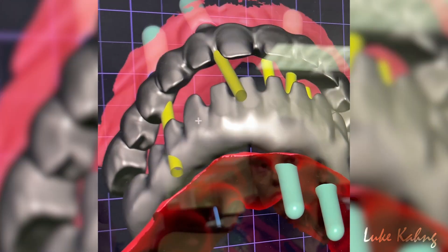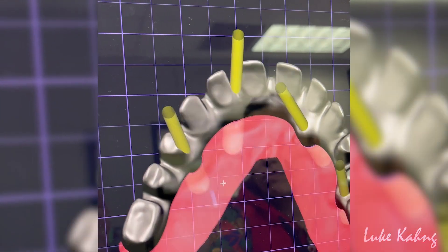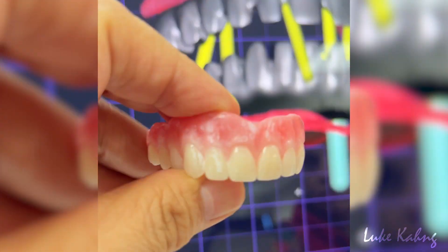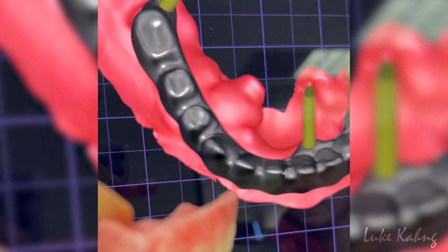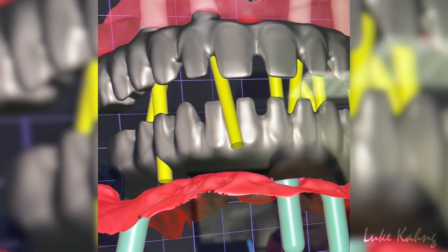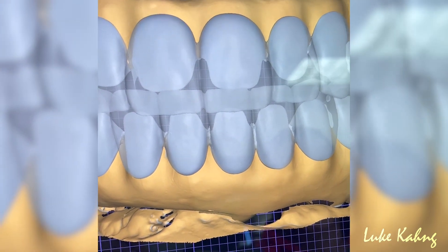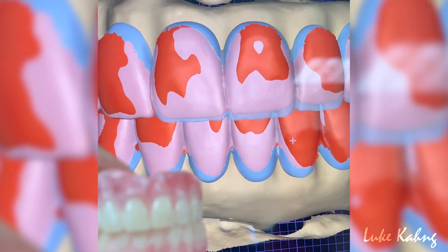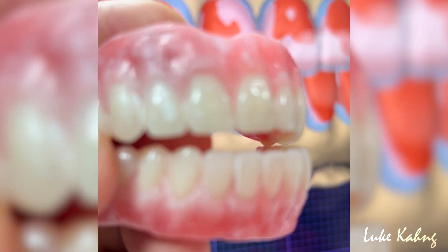Basically we are working with a wax try-in which the doctors already had — this beautiful wax try-in. Now I need a framework, okay, with a backup from here. Now side view — the setup from here.